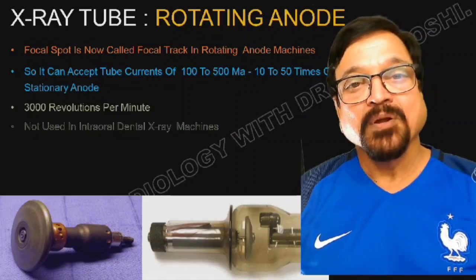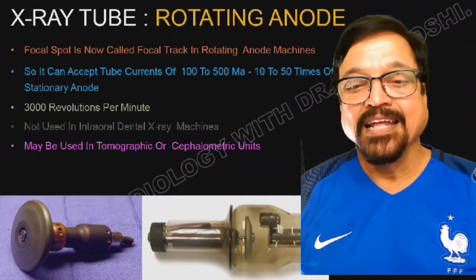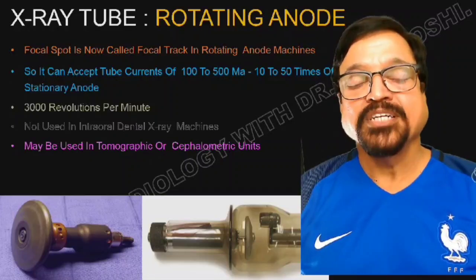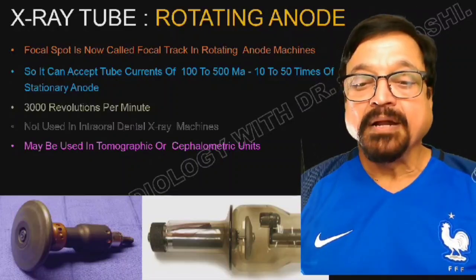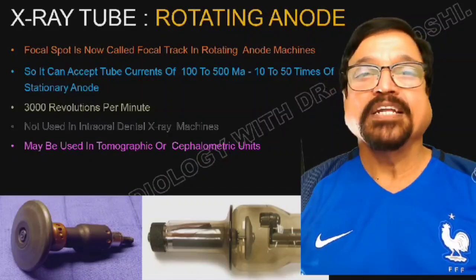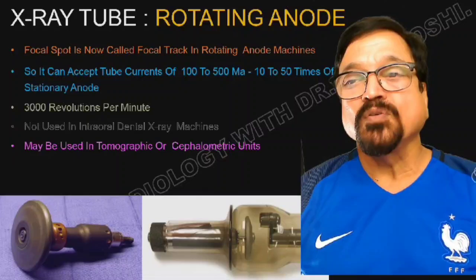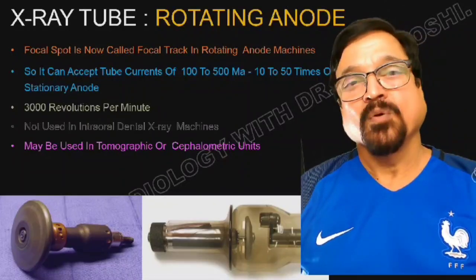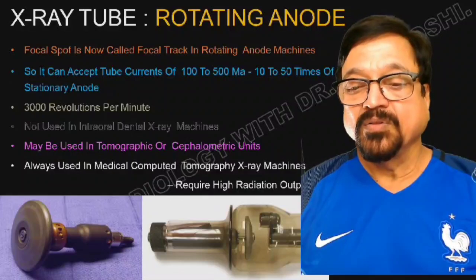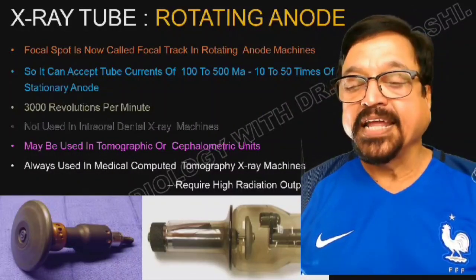It cannot be used for intraoral dental X-ray machines. Why? Because of its larger size. You cannot handle it easily. It has to be mounted on a large X-ray stand and machine. But it is used in tomographic and cephalometric units at certain centers or on some machines. But most of the machines do not have a rotating anode. Most dental machines do not have a rotating anode.